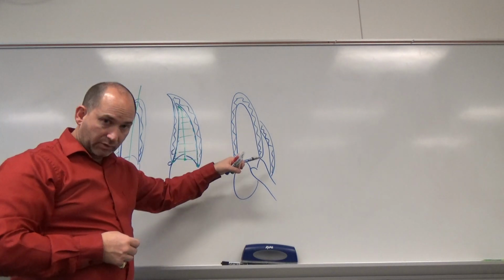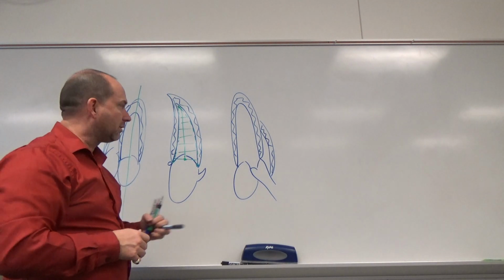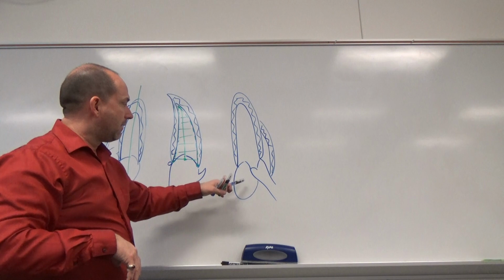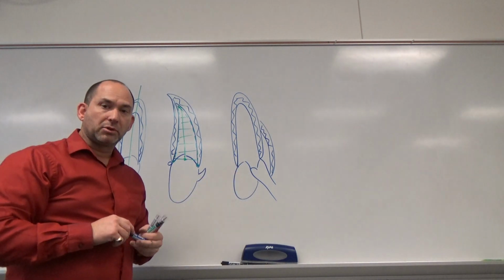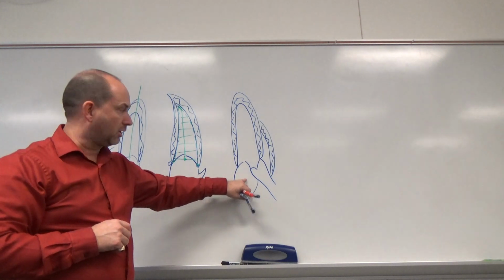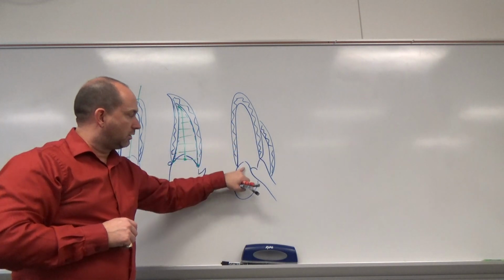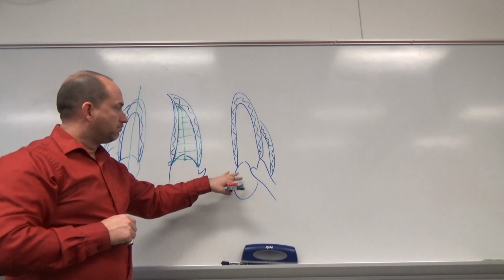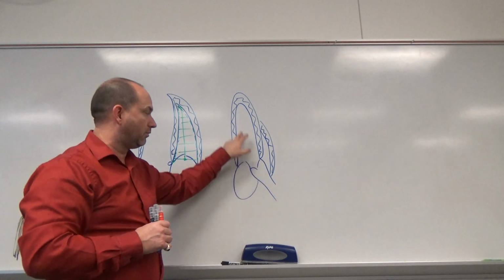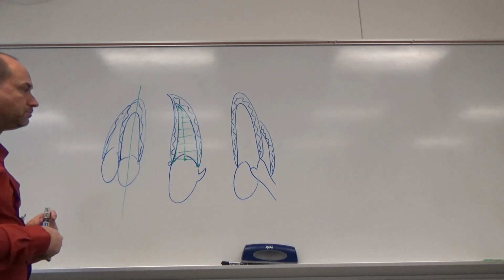And we're going to take a 2D clip of this. We're looking at the walls in it because now we can see without the obstruction at the apex, obstruction of the rib shadows, that is. Then we're going to take a color Doppler of that area as well, looking at the flow, looking for regurgitation from the mitral valve, regurgitation from the aortic valve. This one would be red, this one would be blue. And we're looking for any stenosis or other things like that. This is a great alternative view for doing our aortic Dopplers if we need that.